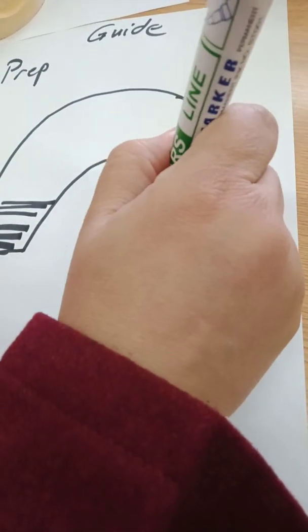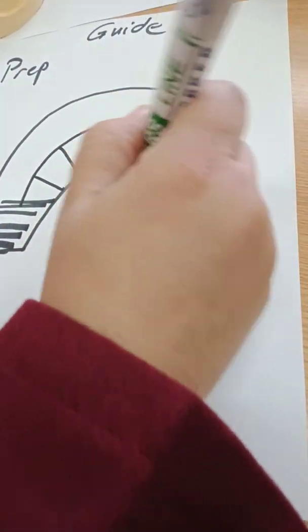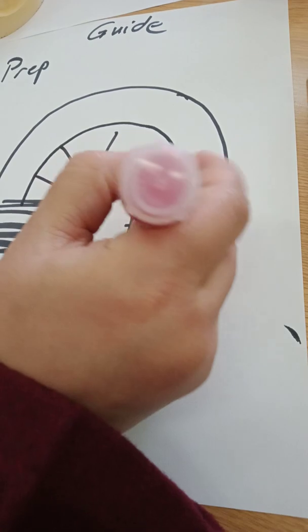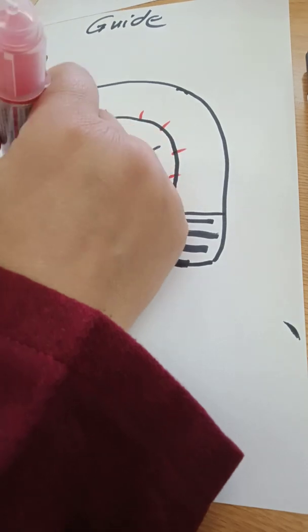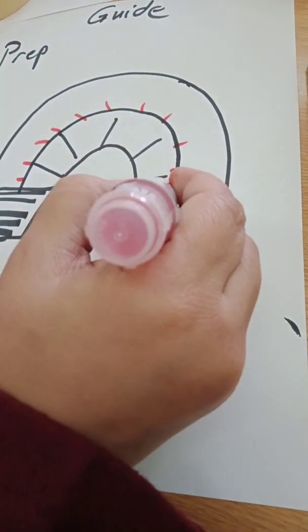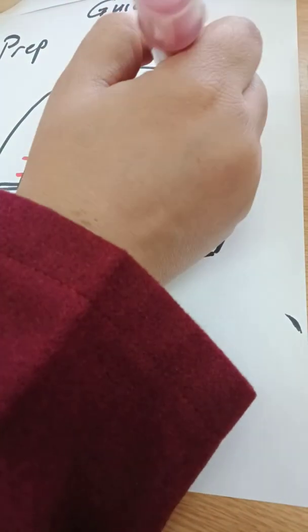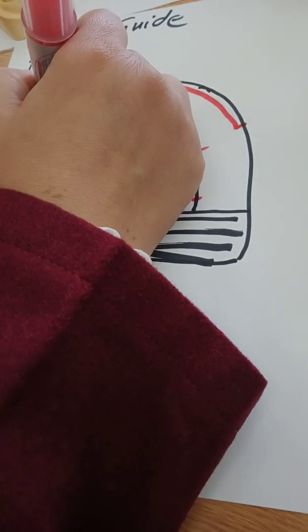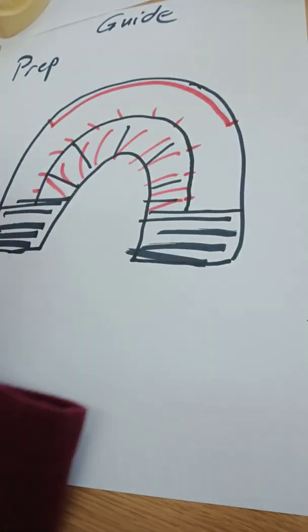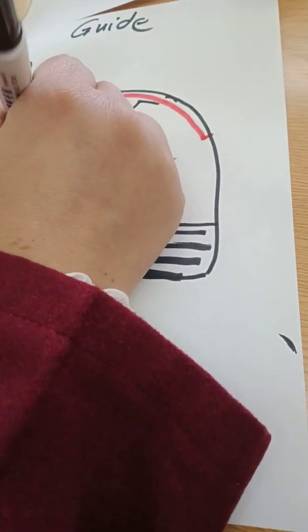But then inside the index, I will do a cut and eliminate this. Let me put it in red. So this is eliminated. I cut it. This line runs from the incisal edges and the incisal edges here and the central groove in the premolar area. So I cut this away. The second cut I cut away is, if this is the incisal edges, reaching 1 millimeter above the incisal edge. So suppose these are incisal edges, it's above incisal edges, just close to the incisal edges.